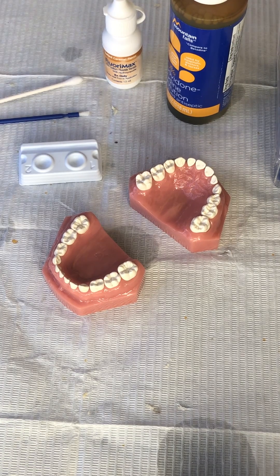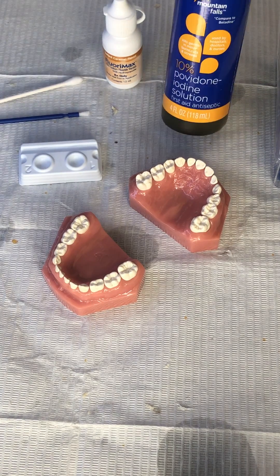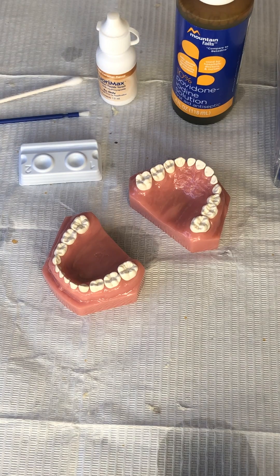Hey friends, here's everything you need to use iodine and fluoride varnish to prevent cavities.